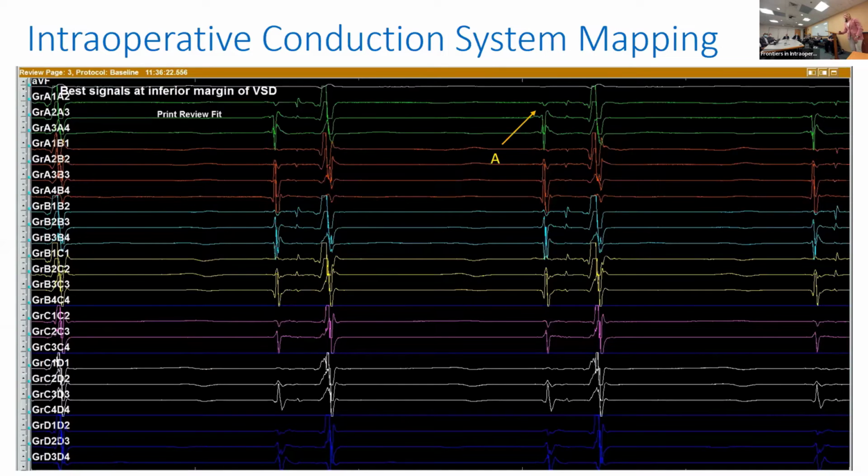And the signals that we see here, the first one is the atrial electrical signal. The second is the signal of the His bundle electrogram. And then the third one is the ventricular electrogram. When we do EP studies, we have a catheter that sits at the His bundle and looks at this throughout our cases so that we're not causing injury there. But that is how we display these in the operating room.